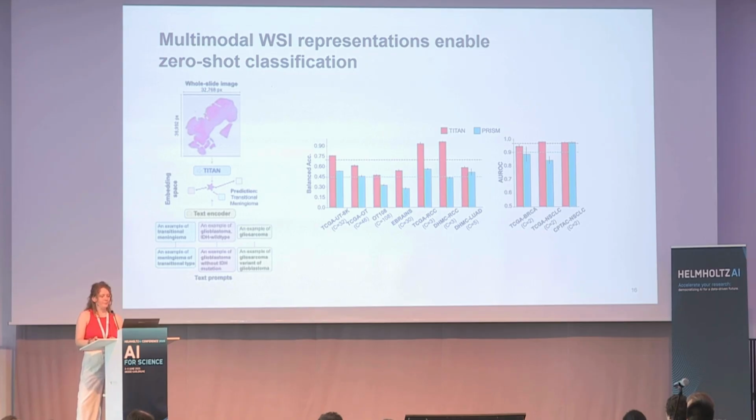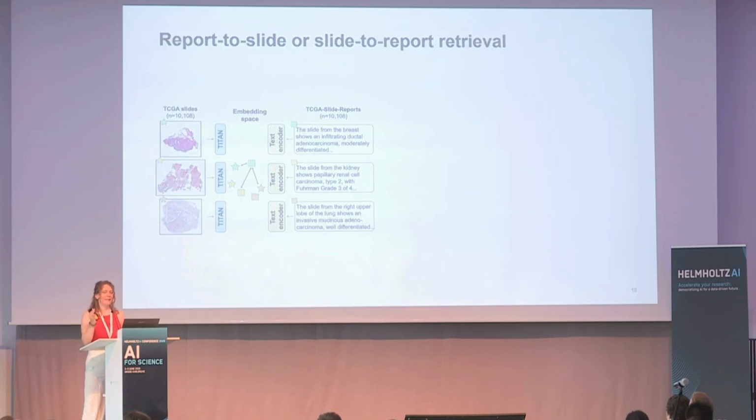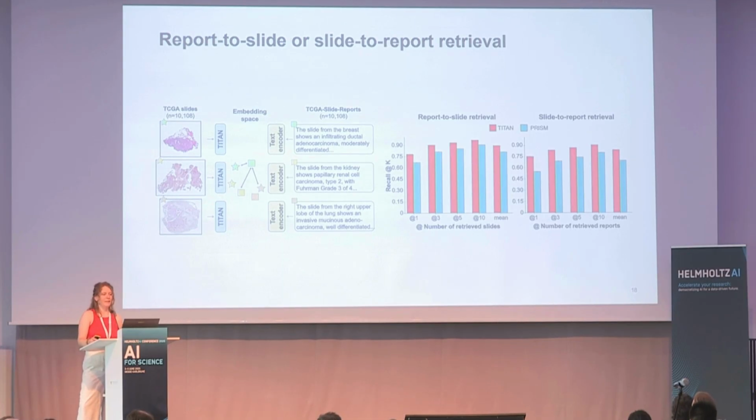And finally, two other architecture ablations, which we can discuss later. Another retrieval task is now also this report-to-slide retrieval. If you have a clinical condition and you're searching for similar slides, it's in a way like consulting another pathologist, and you can consult the clinical history before.